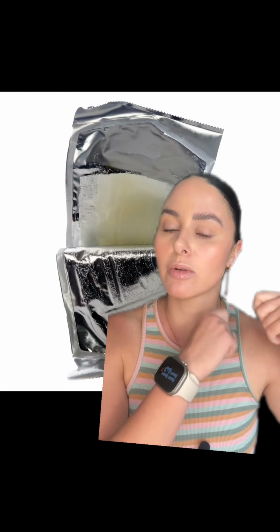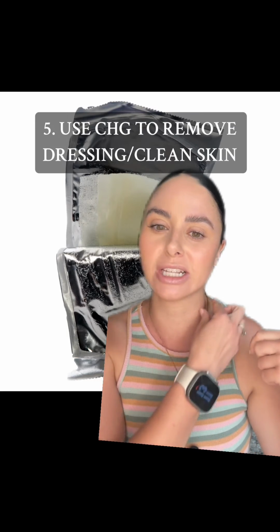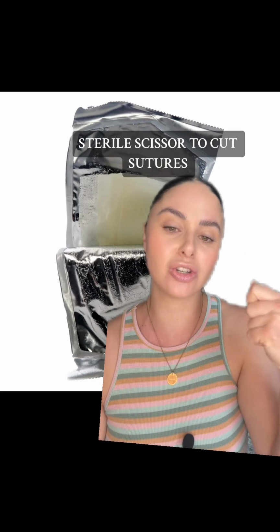Once the patient's flat, I've got all my supplies ready. I'm going to go ahead and start removing that dressing, and I'm going to use a chlorhexidine swab to remove any securement devices, kind of clean the area, making sure it's nice and clean prior to me putting the dressing on. And you can use your scissors to cut the sutures.